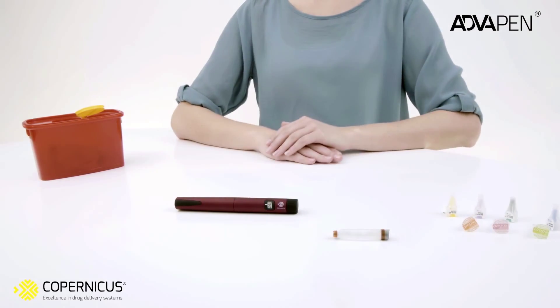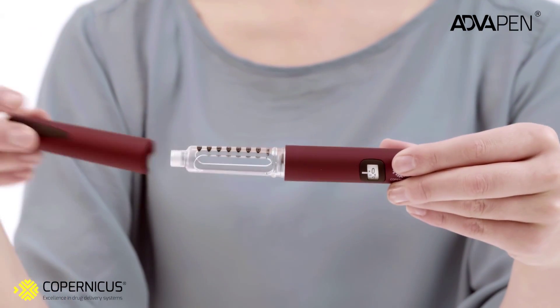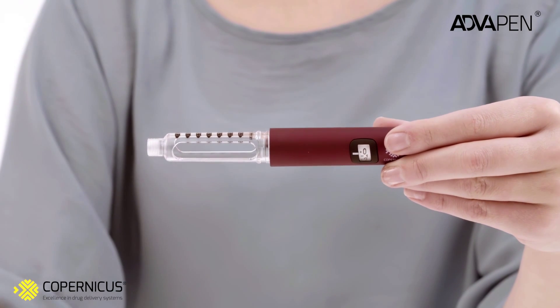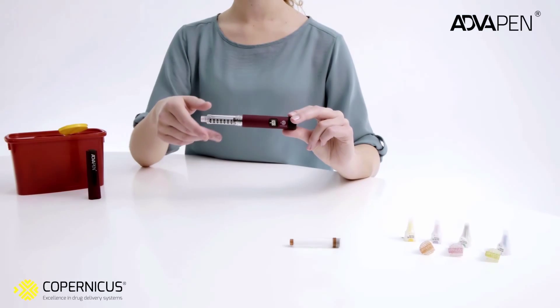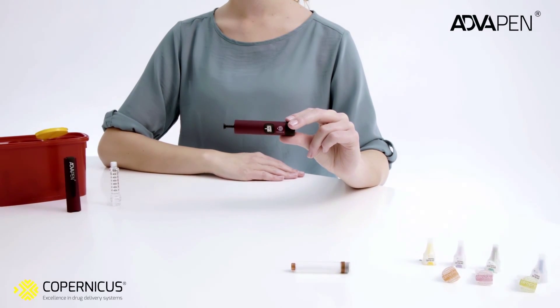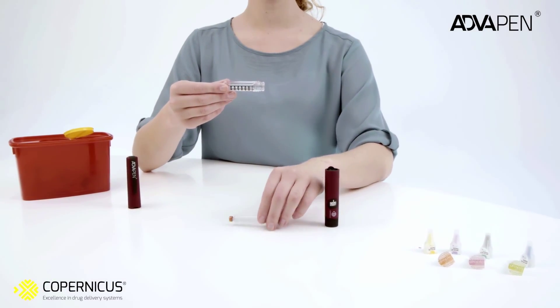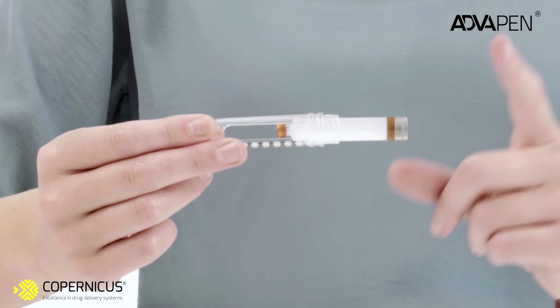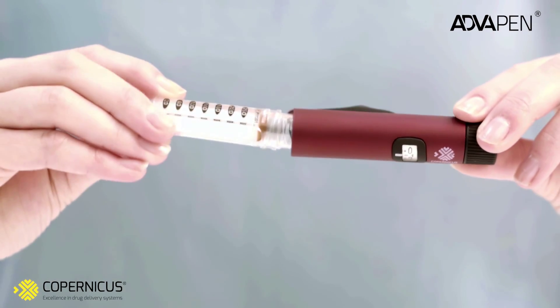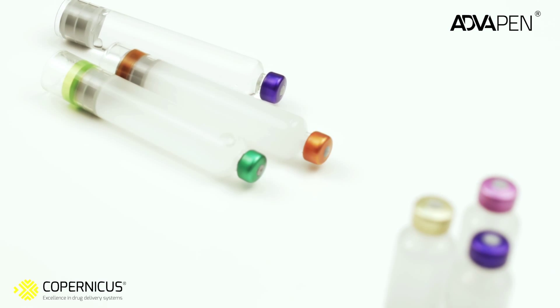Pull out the cap. You will then see the transparent cartridge holder — unscrew it by turning it counterclockwise. If the piston rod sticks up, press it into the pen body. Insert the insulin cartridge into the cartridge holder with the rubber tip to the front. Attach the cartridge holder to the pen body by turning it clockwise.